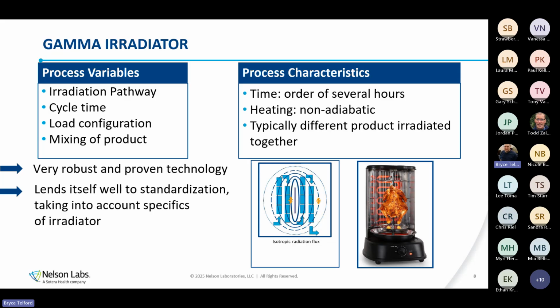Heating is non-adiabatic. So what does that mean? Well, because dosing is over such a long period of time, keep in mind that every sterilization method, every single one, is taking energy and adding it to the system in order to inactivate microorganisms. In the case of ethylene oxide, that energy is chemical energy as well as some thermal energy. When it comes to steam sterilization, we're talking thermal energy; liquid chemical sterilization, of course, chemical energy. With radiation, we're talking about ionizing radiation.